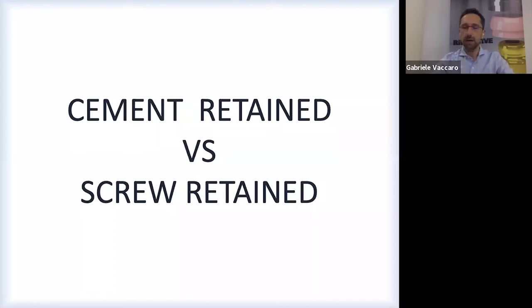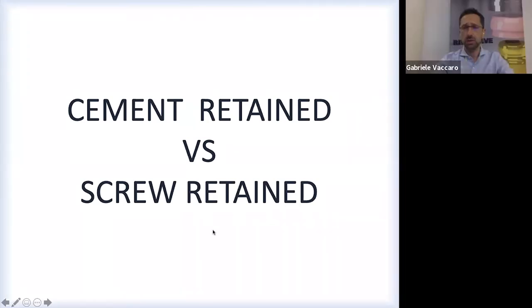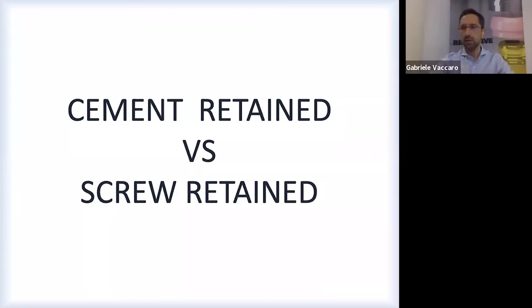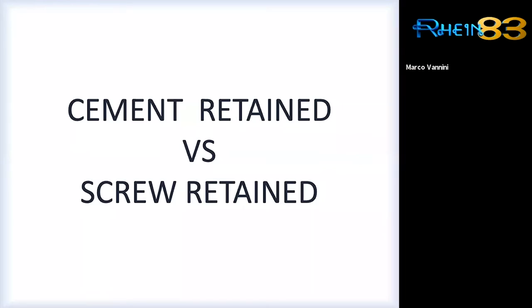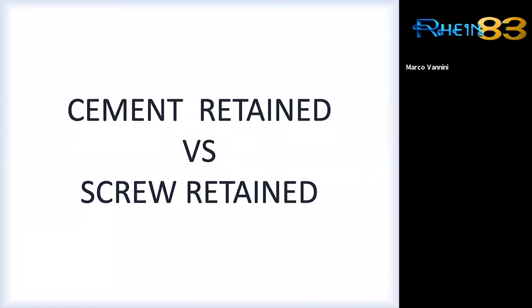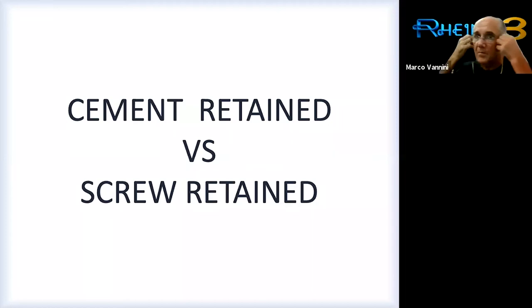If you have a fracture of the porcelain, or you need to remove your screw retained, it's easy to unscrew the fixing screw, and then you can fix it. But there are also some issues with screw retained prosthesis. For instance, to fix strong disparallelism between implants is very difficult.